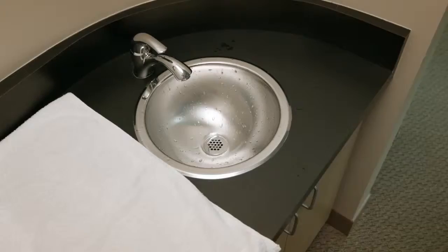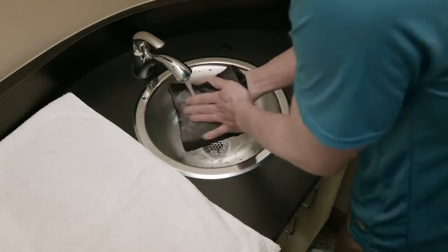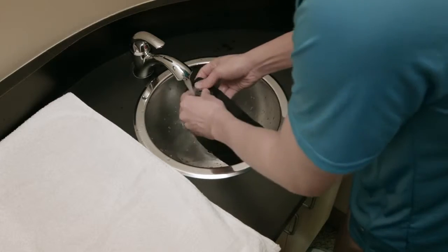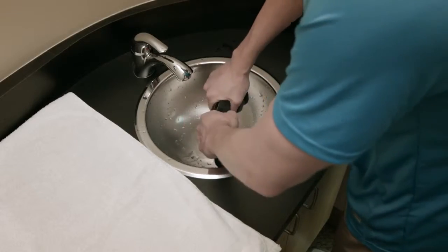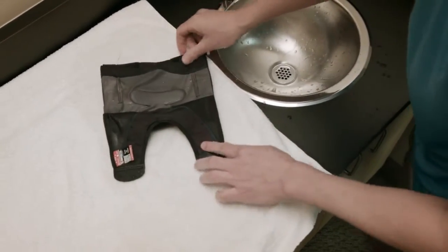You'll need to clean your FreeSport sleeve periodically depending on how active you are or how much you perspire. To clean your brace, hand wash it in cold water with mild soap. Rinse thoroughly and lay flat to air dry. Do not machine wash or tumble dry. After exposure to salt water or dirt, thoroughly rinse the brace with fresh water and allow to air dry.